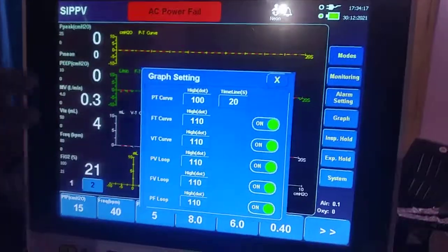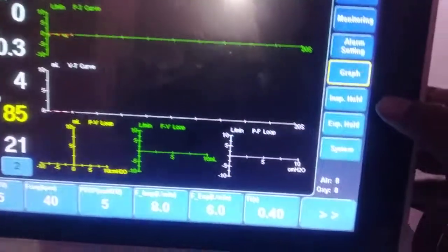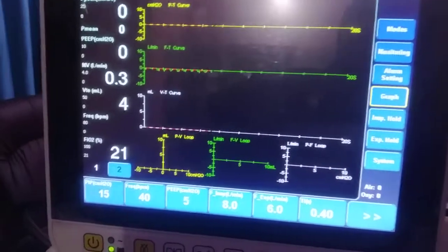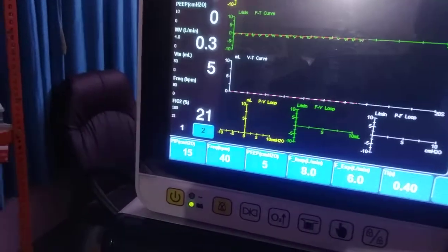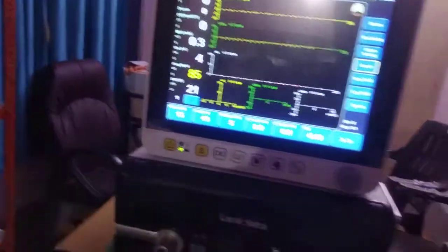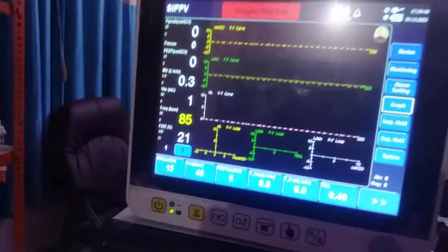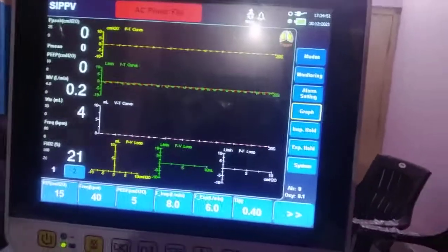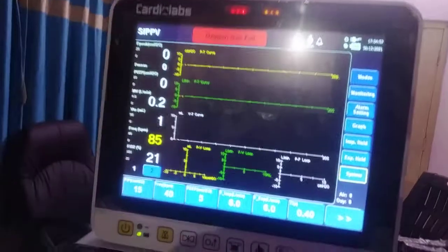This is your graph option — if you want all graphs and loops to be removed from the display, you can switch them off from here. You can also perform an inspiratory hold and expiratory hold directly from here. Inspiratory hold and expiratory hold are very important because with them you can find the delta pressure, trapped volume, and intrinsic PEEP. We will discuss how to use these in a later video.